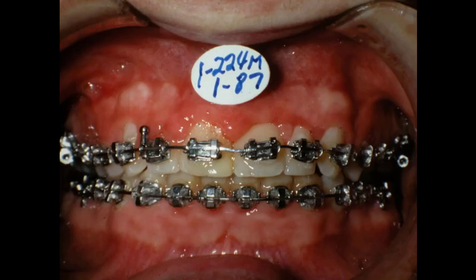Anyway, here he is during the treatment. No special thing. We used twin brackets on the front teeth. I don't normally do that. I just usually put those little bitty ones. These are single brackets with wings on them back here, and I think this would be good for you people to start off with these. Anyway, they help you rotate.